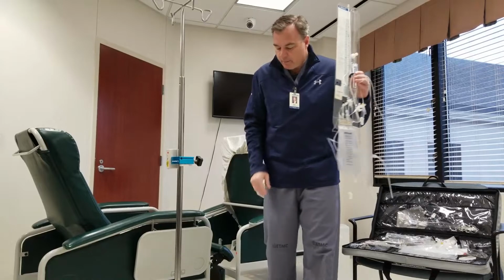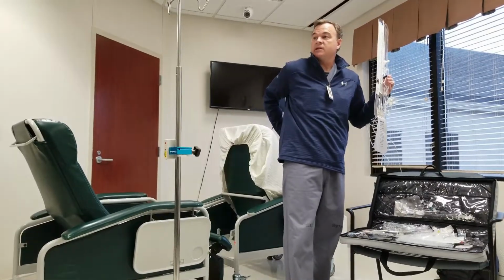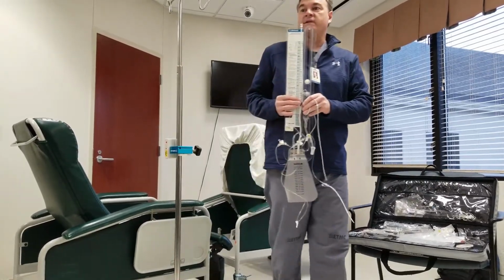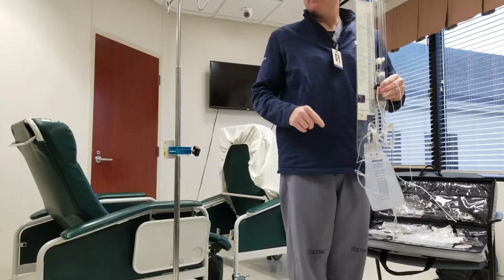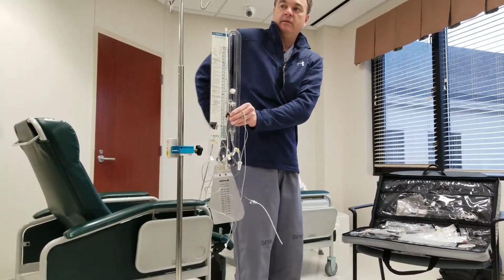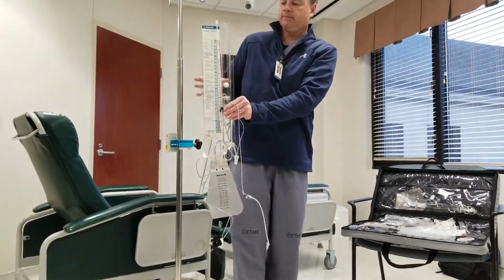So, the patient comes from the OR. They've got a lumbar puncture site, which is important for you. It's usually got a Tegaderm or some sort of packaging or taping over it. That's important because that is actually the 0 reference. So you'll see 0 right here. Typically, as they're lying down, you want to keep that in line with the puncture site, because that's basically the frame of reference for how much pressure it's going to take to open up the drain.